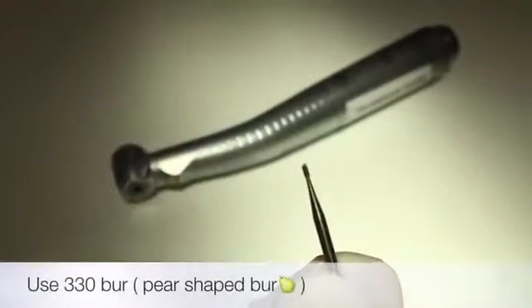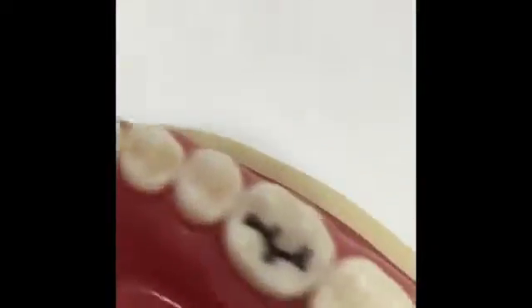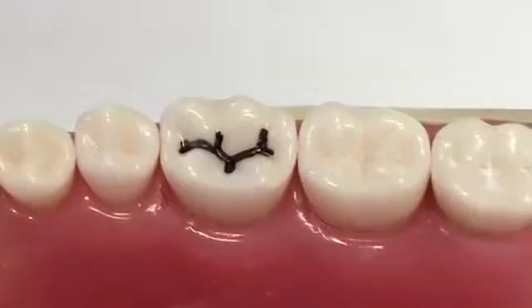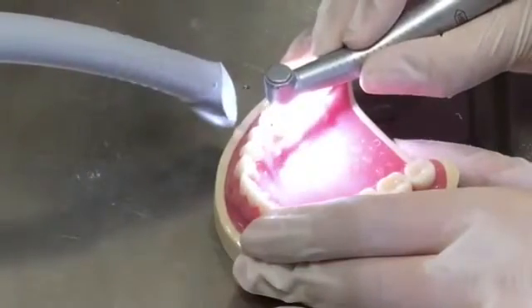The burr we're going to use is the 330 burr, also known as the pear-shaped. We are going to insert it into the high-speed handpiece. After that, we're going to locate the caries. As we said before, Class 1 occlusal caries were found on tooth number 46. Now let's start drilling.